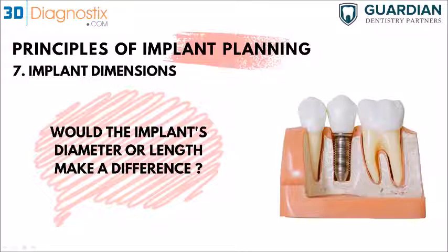Got it. So basically you do that, get to the bottom of the sinus, and then you take out the surgical guide and do it the way you do it. Yep. Or if you have the guided kit, then you can use the drills, the stops, of course, to just elevate the floor of the sinus and finally place in the implant.